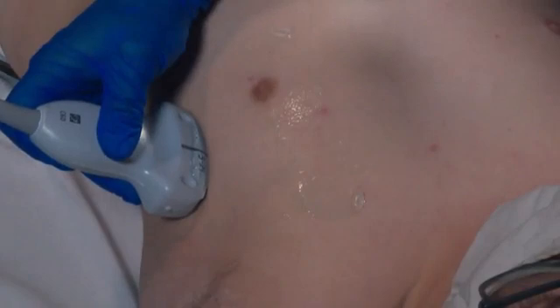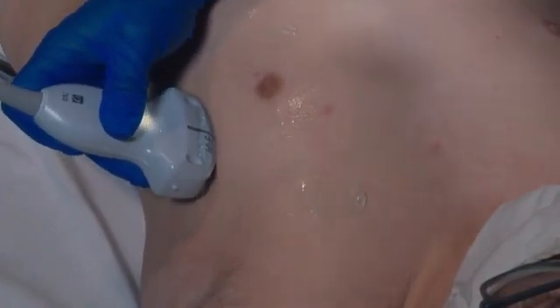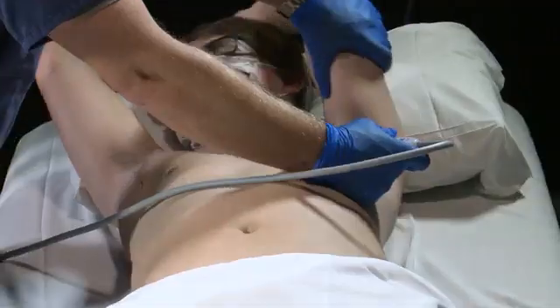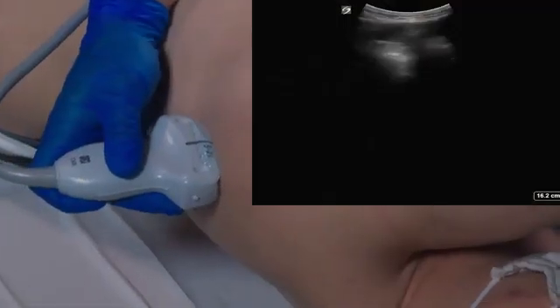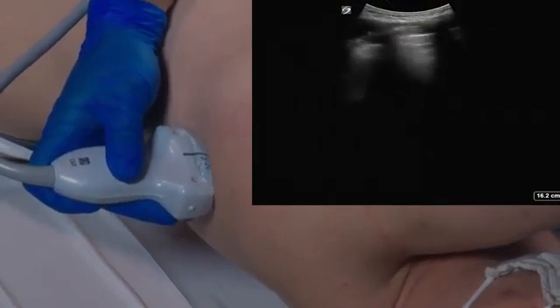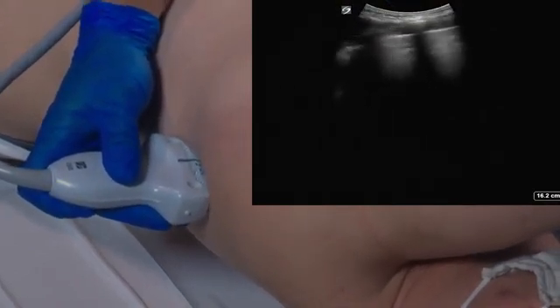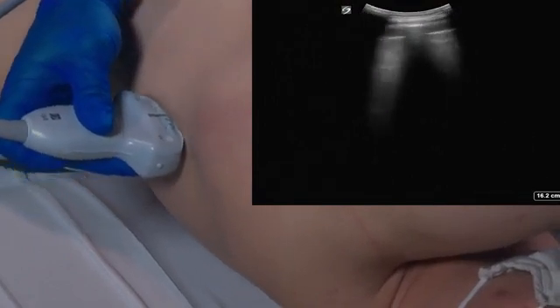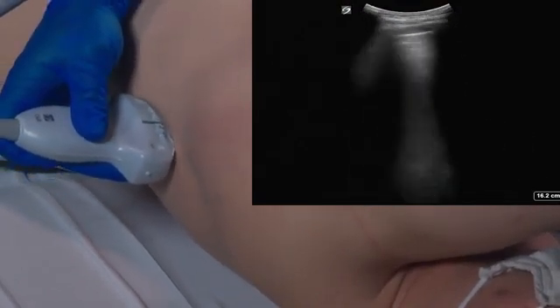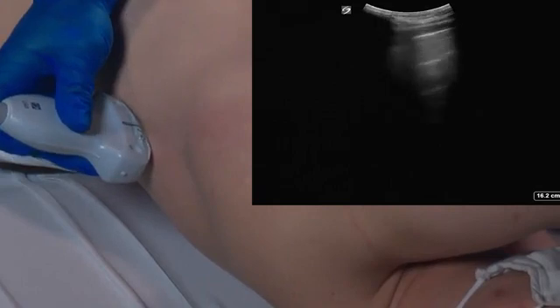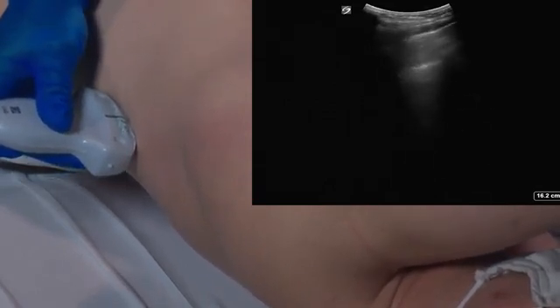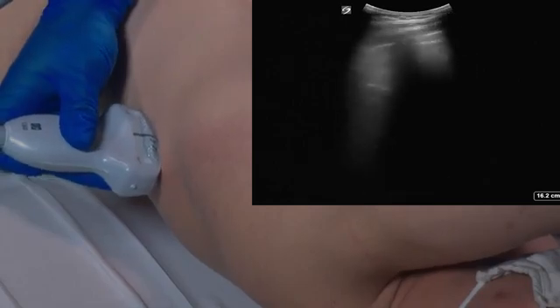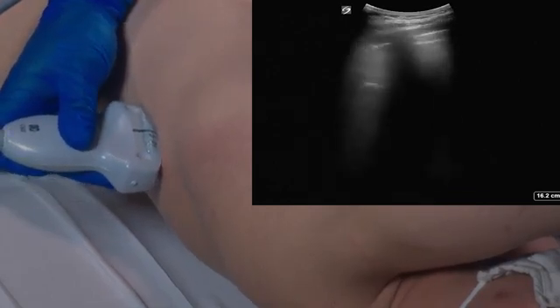Finally, we're going to image the posterior zone. To do this, we need to roll the patient up onto their side and place the transducer just above the scapula, between the scapula and the spine. We're going to image the posterior chest in several different areas all the way down until we can identify the diaphragm, again looking for any evidence of B lines.